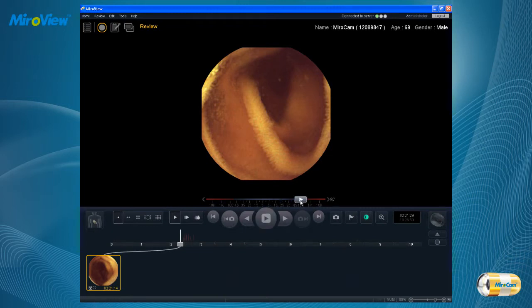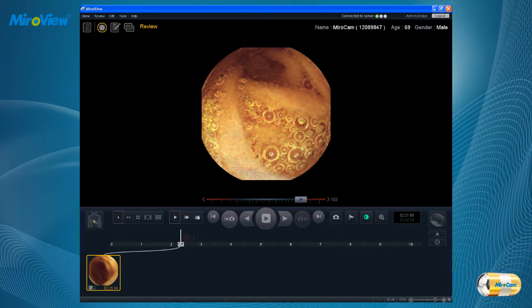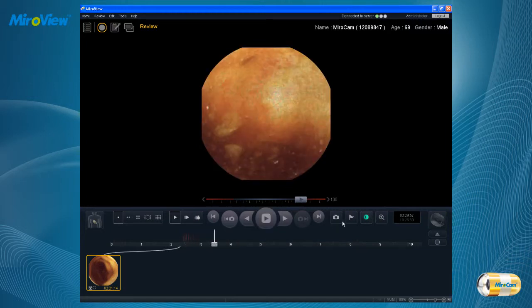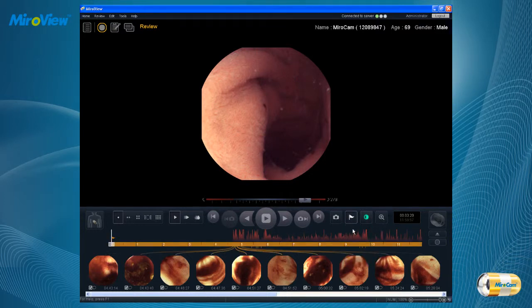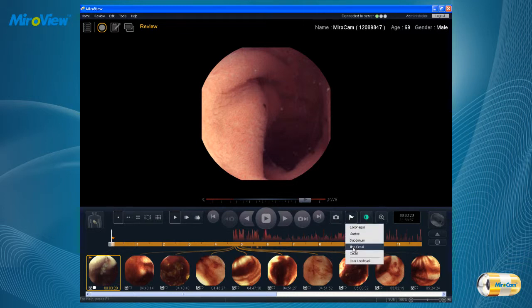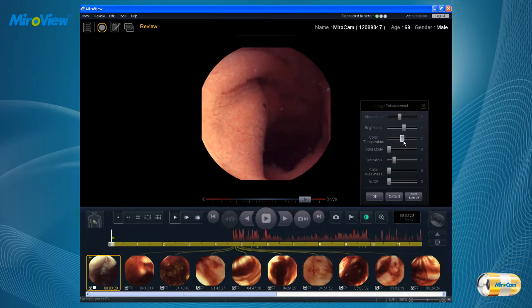An image can be captured by simply pressing the Enter button or by double-clicking on an image on the main screen. Images can be enhanced to the user's preference, and pathologies can be viewed more easily using the nine pre-selected ALICE colors.